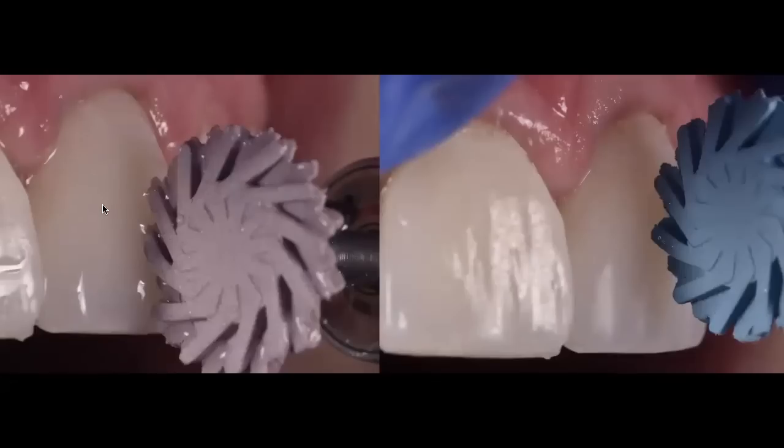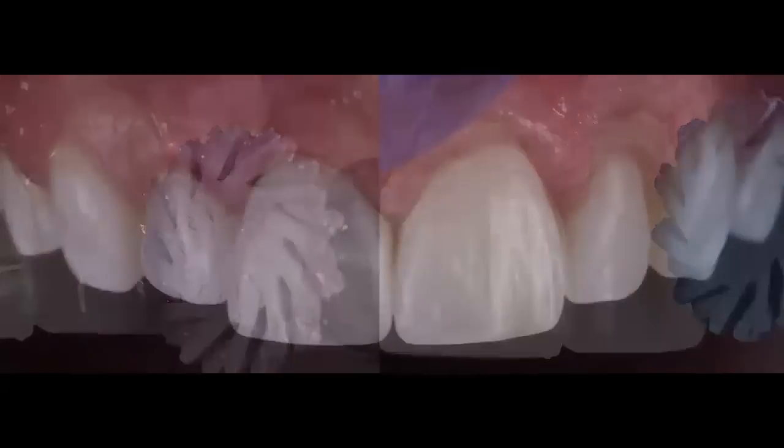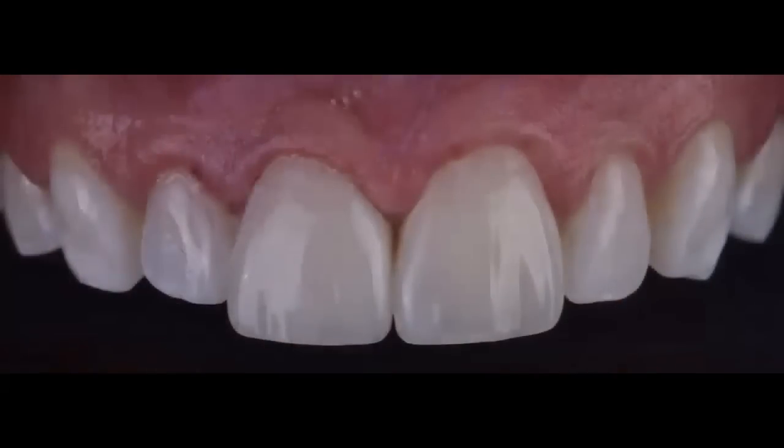So I use my diamond burs to recreate some of the texture. I use some finishing discs so that I can get the right shape and the right length. And then finally I do my high gloss polishing using these Shape Guard wheels. The reason why I like these Shape Guard wheels is because you get a high gloss without removing the texture that you worked so hard to obtain by using different diamond instruments.